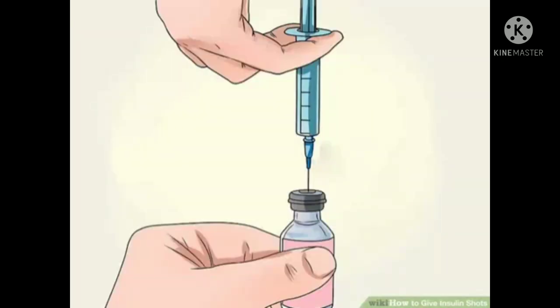Fill the syringe with one type of insulin. Before filling the syringe, check that you have the correct insulin type and that it's not expired. Liquid insulin should never have clumps in it. Sanitize your hands before removing the plastic cover from the insulin vial, then wipe the top of the vial with an alcohol wipe to disinfect it.